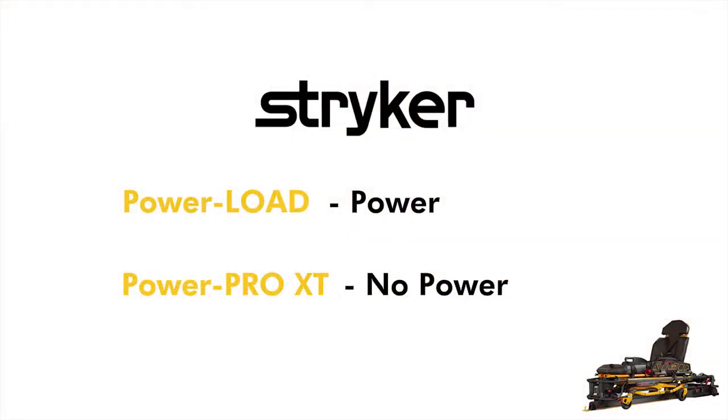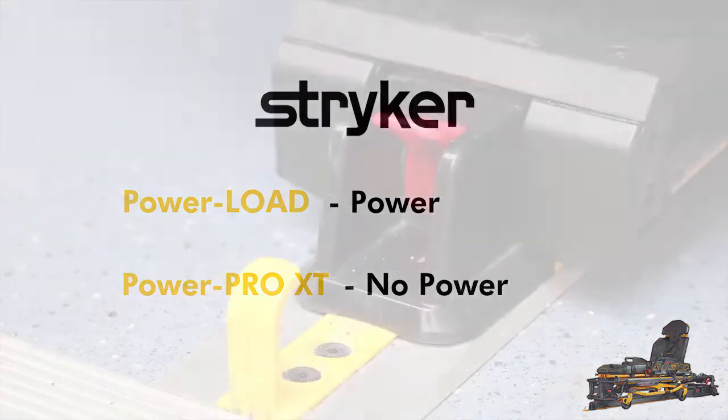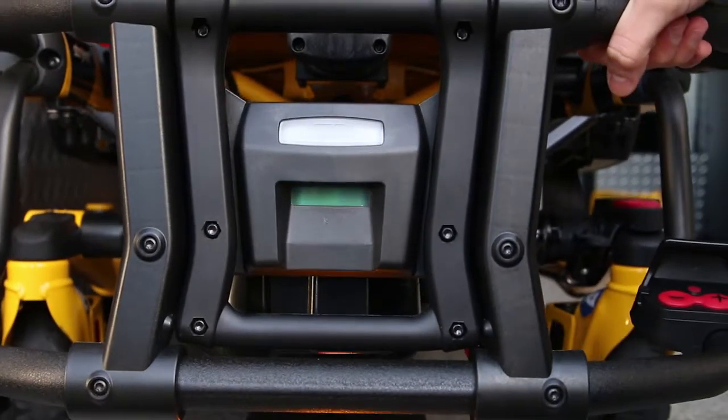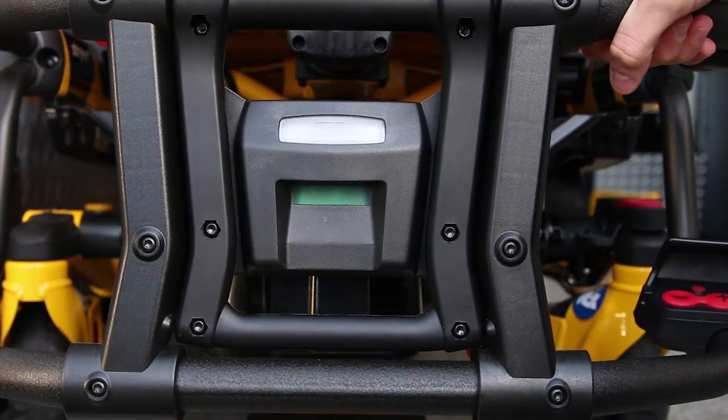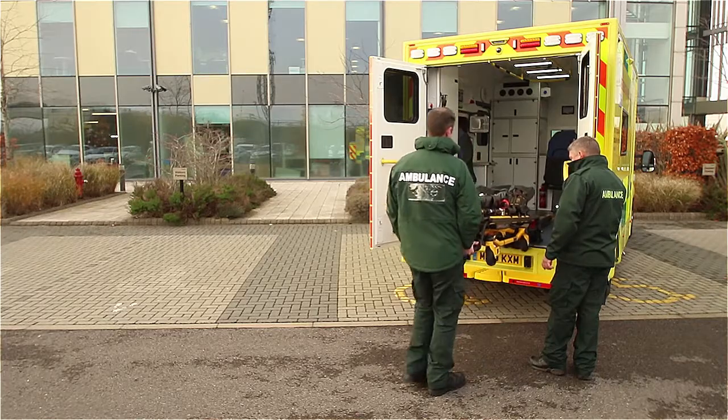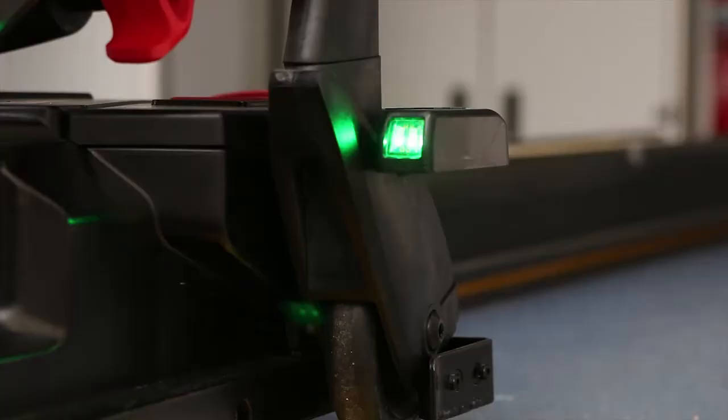In this scenario there is no power to the PowerPro XT stretcher. To unload in case of battery failure, press and hold the red release lever at the foot-end of the PowerLoad. The PowerLoad will raise slightly, indicating it is activated and supporting the weight of the stretcher. Guide the stretcher out until the head-end LED indicators turn solid green, indicating the stretcher is ready to be lowered and taken away from the vehicle.